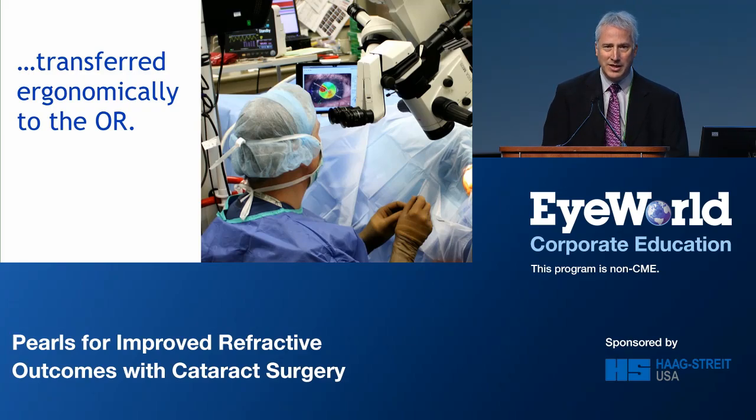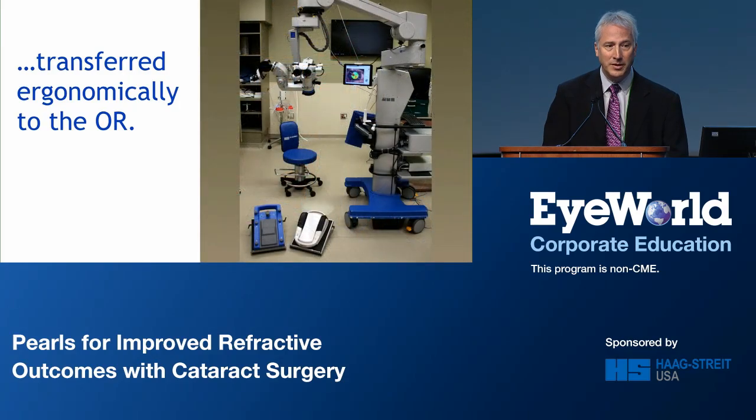Now, some of you may not be as lucky as I to have the wonderful Haag-Streit microscope available. Haag has actually made the platform available so that the Lenstar software can be run on Citrix. And this image is actually showing the Lenstar software run on Citrix, showing up on an iPad on a flexible device, which I can glance up at, even with a different kind of microscope and OR system. You can see just to the left of the base of the scope, there's an articulating arm holding up that iPad, and I can put it wherever I want to look at it very ergonomically.